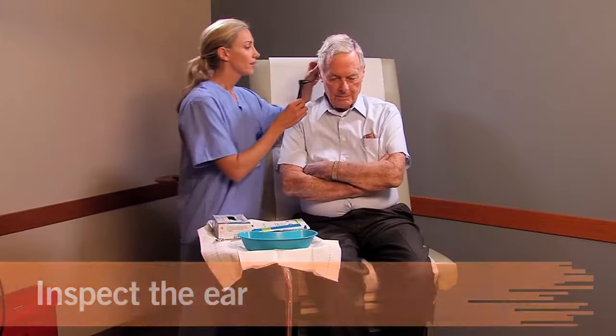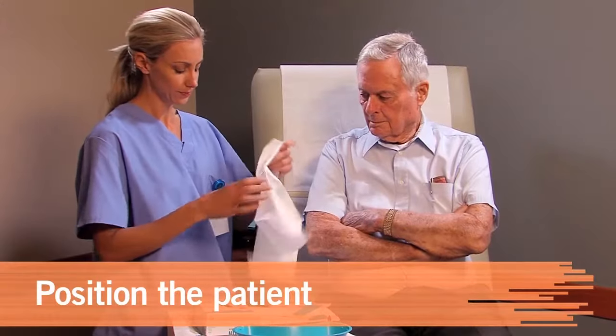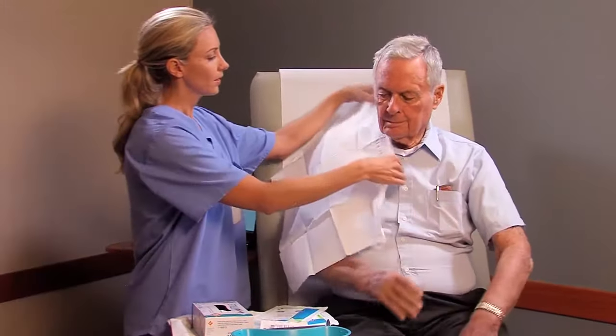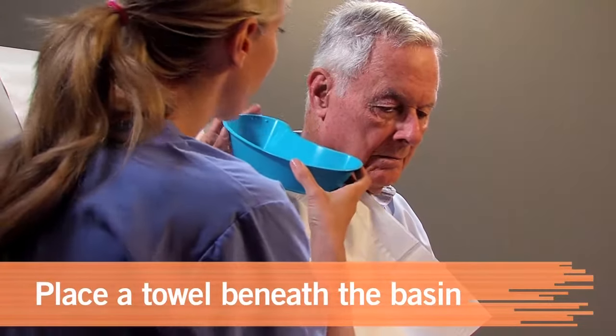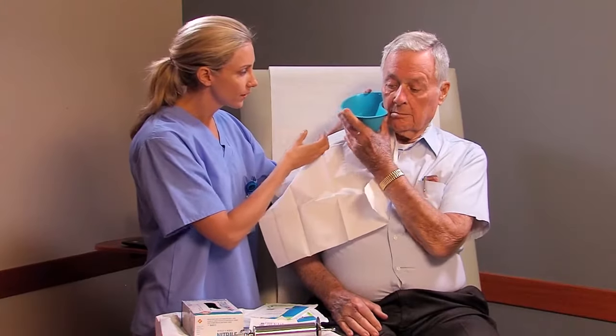Use an otoscope to check the affected ear and locate the cerumen impaction. Place the patient in a sitting position with his head tilted toward the affected ear. To keep his clothing dry and direct the flow of the solution, place a towel over a poly-lined barrier on the patient's shoulder. Place the collecting basin on the towel beneath the ear.